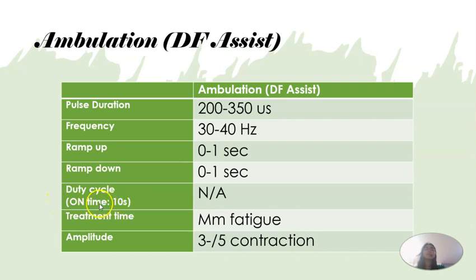Treatment time, okay, kapag napagod na si patient, or hindi na ma-elicit yung dorsiflexion, ibig sabihin nagkaroon na ng fatigue sa muscle. Okay, pag hindi na na-elicit yung dorsiflexion, alright, ibig sabihin nun, stop na.